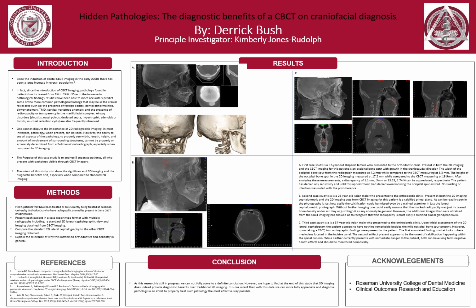If you take a look at the lateral ceph, it was noted that the width of that bone spur was 7.2 millimeters. However, when we measured it with the actual CBCT image, its width was 8.3 millimeters, so about 1.1 millimeter in difference.